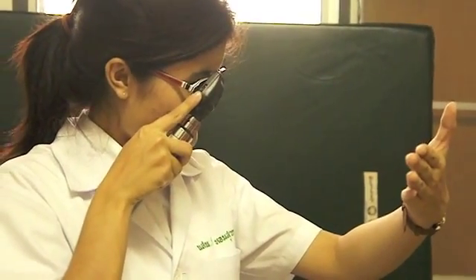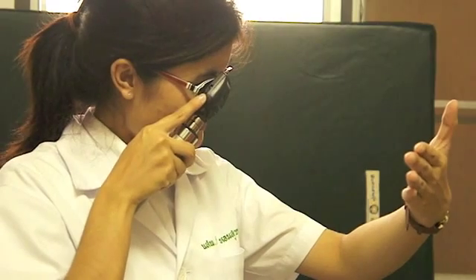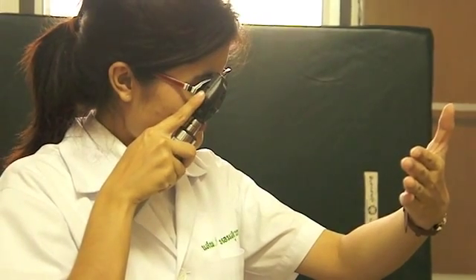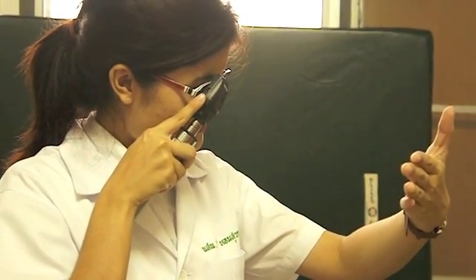วิธีตรวจจอประสาทตาโดยใช้เครื่อง Direct Ophthalmoscope ผู้ตรวจปรับเลนสายตาตามสายตาของตน ถ้าผู้ตรวจมีสายตาสั้นหรือยาว ควรสวมแว่นเพื่อภาพที่คมชัด (Method for retinal examination using the Direct Ophthalmoscope: the examiner adjusts the lens to match their own vision. If the examiner is myopic or hyperopic, they should wear glasses for a sharp image.)